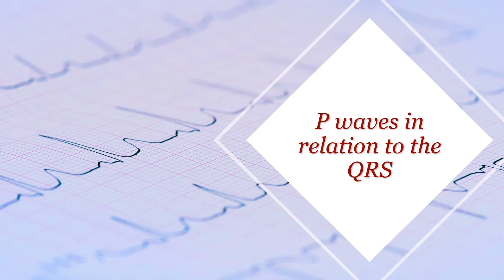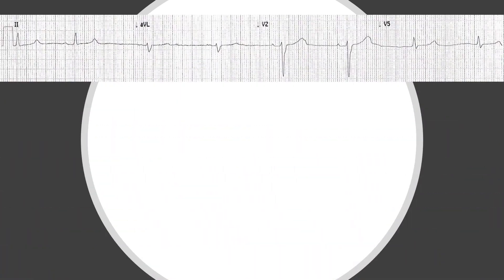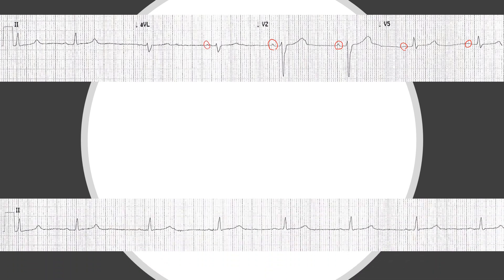Now we move on to the question we haven't addressed yet in our approach: what are the P waves doing with the QRS complexes? Looking at this part of the ECG, I think I can see only one P wave before each complex. Checking the rhythm strip of the same ECG, I don't really see more than one P wave before each complex, with a prolonged fixed PR interval of 204 milliseconds. So you could easily say we have a first degree heart block here.